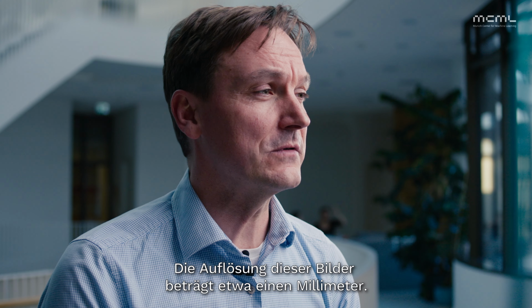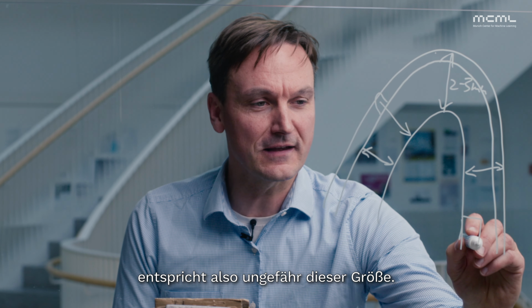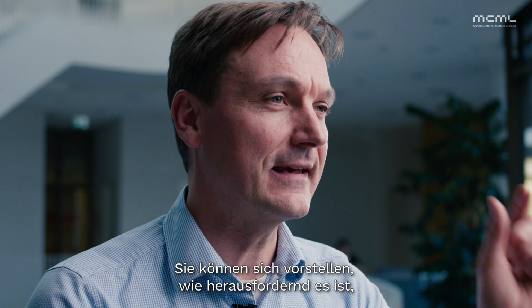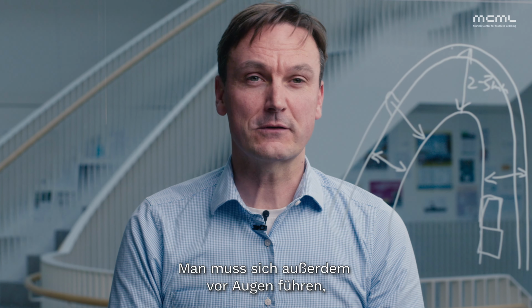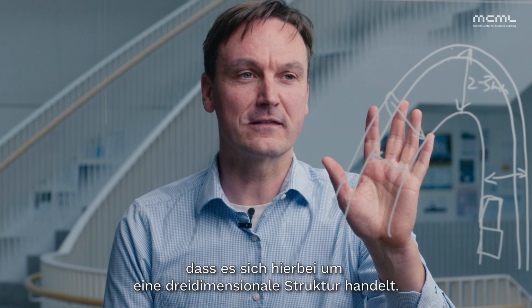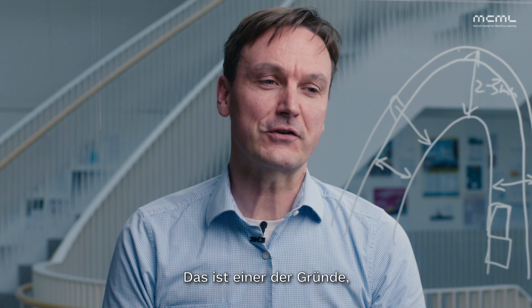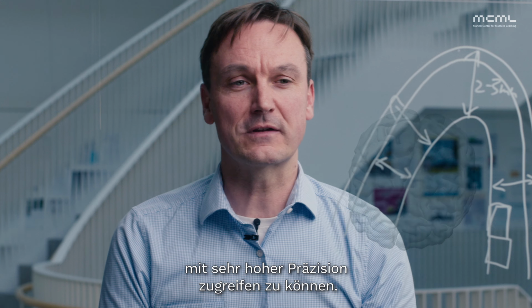The resolution of these images is just about 1 millimeter. So 1 pixel of the image would be about this size. So you can imagine when we have to manually try to assess the thickness of the cortex, this is a very challenging task. Further, you have to keep in mind this is actually a 3D structure, and this is just a 2D slice. So this is one of the motivations why we're interested in having this automated reconstruction of the cortex, so that we can have access to these measurements in very high precision.